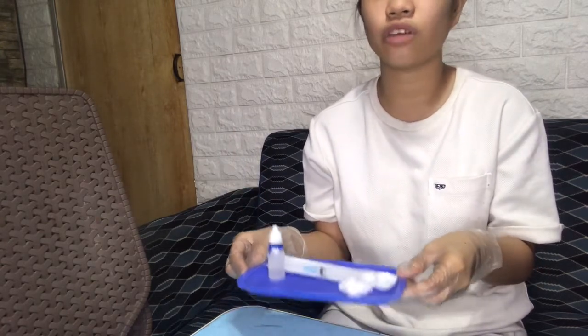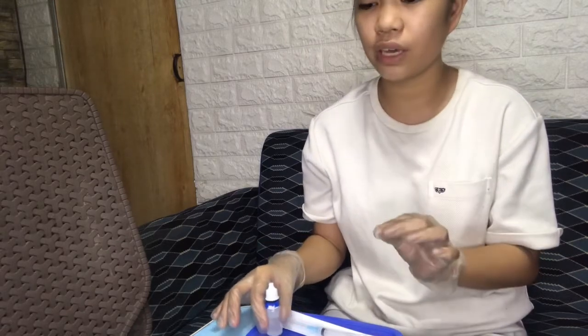So as you can see, I already wear my gloves because I already did the hand washing. So the rationale for that is to not spread any microorganism to the patient, especially to the medication. So prepare the medication vial for drug withdrawal. So these are the things that I will be needing in this assessment.